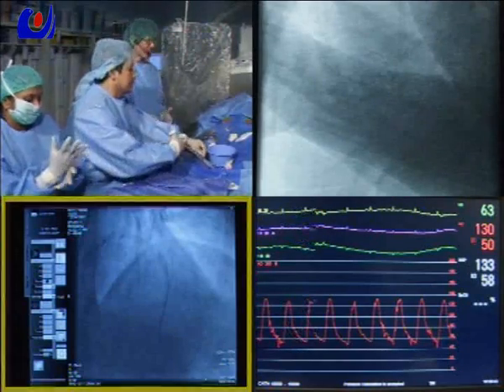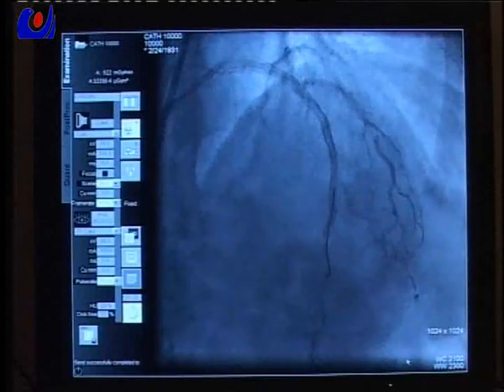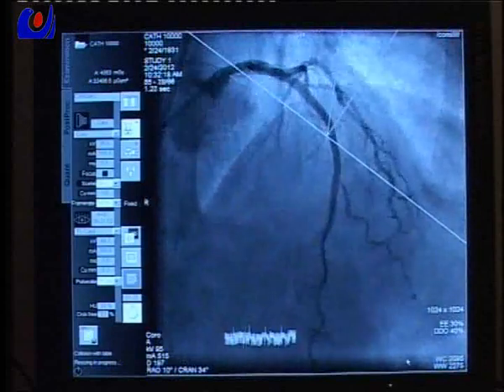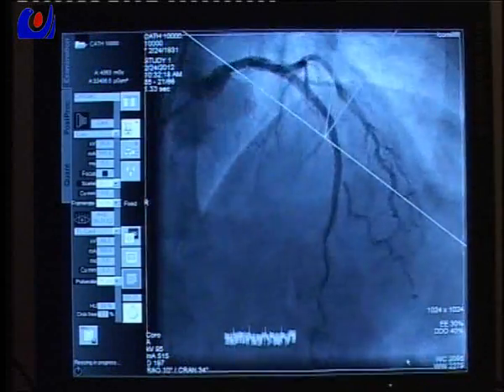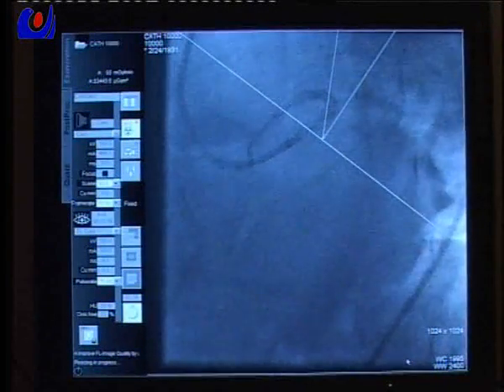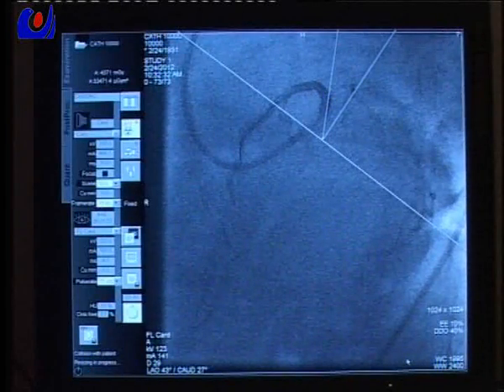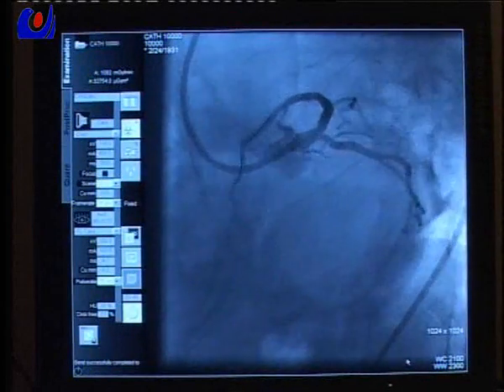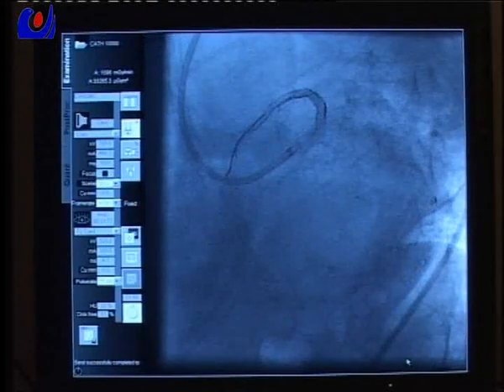All right, perfect. Take another spider. Yeah, spider. And how about the left main? You calculate the minimal stent area. Okay, testing. Oh, push harder. Push harder. All right. Yeah, I think it's acceptable. Okay. Cross here.